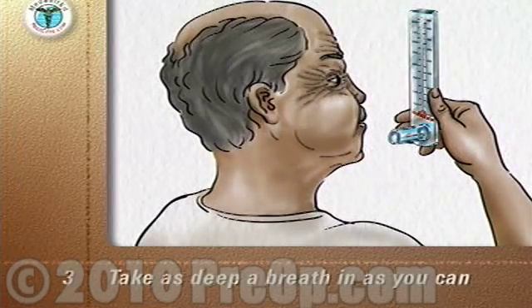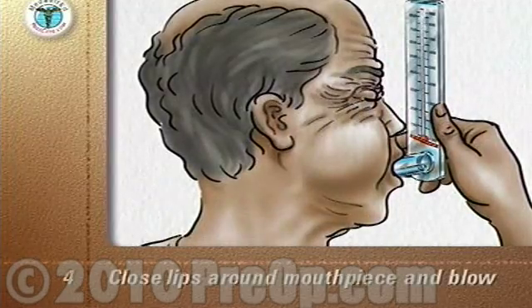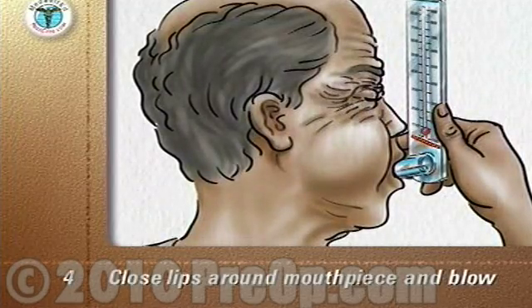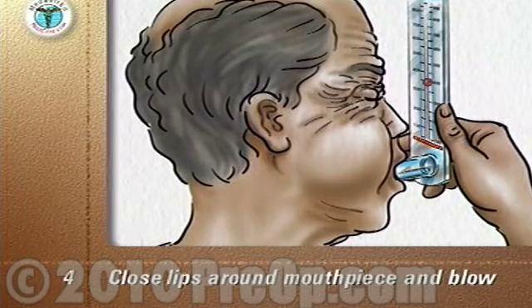Take as deep a breath in as you can. Close your lips firmly around the mouthpiece and blow out as hard and as fast as you can, just like blowing out candles on a birthday cake.